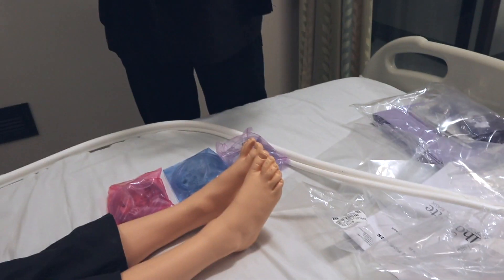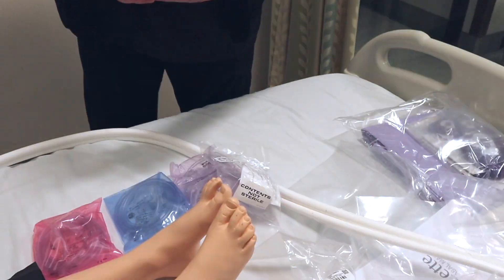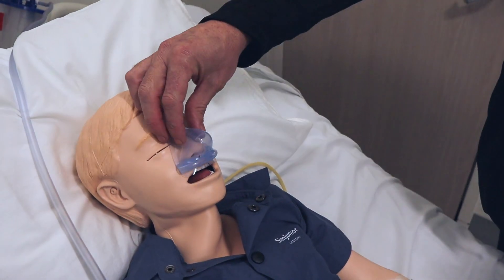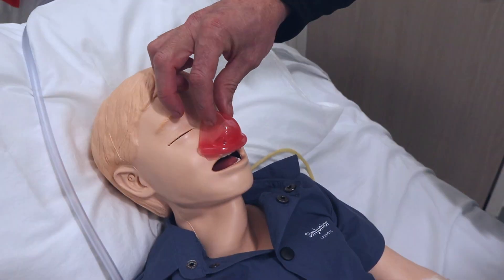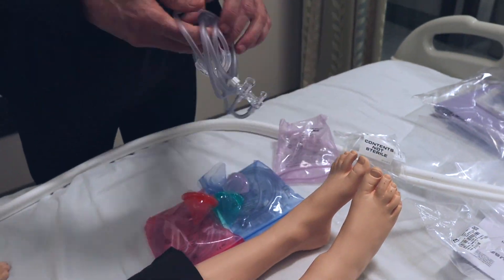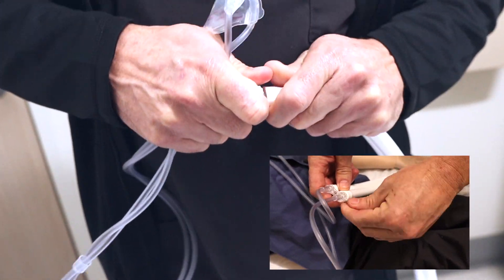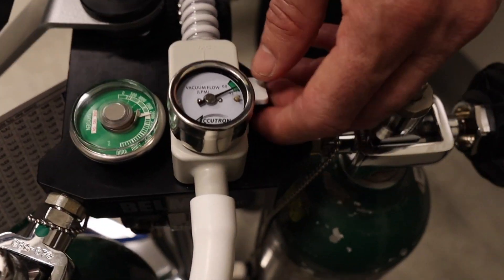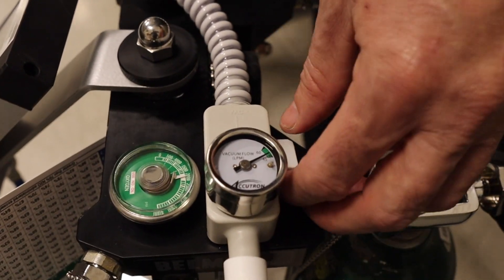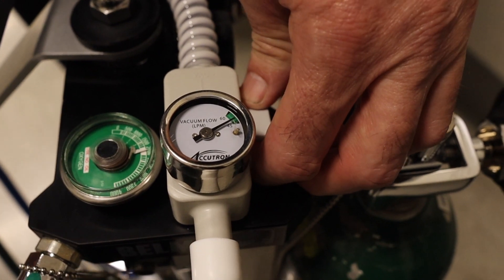Next, size the mask by placing the sizing guides included with the circuit to the patient's nose. The ideal mask should fit comfortably without allowing much leak. Open the appropriately determined nasal mask size and attach it to the other end of the circuit. Finally, test the suction lever to make sure the scavenging system can be adequately controlled before turning on the nitrous.